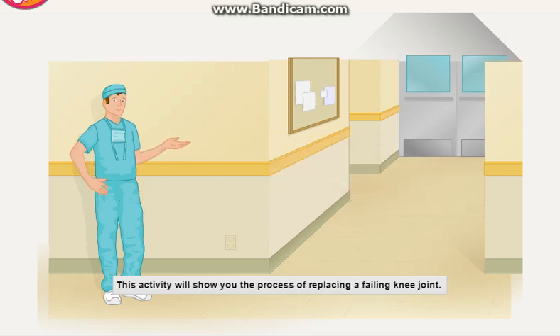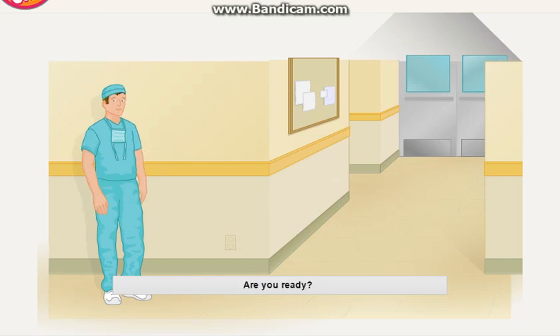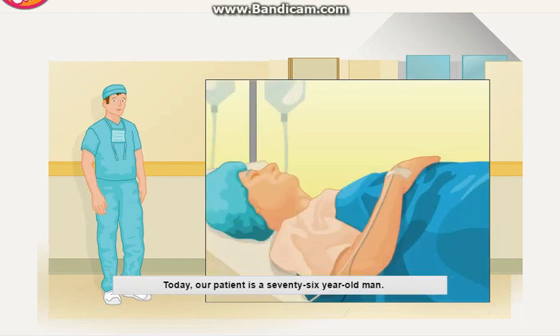Virtual knee surgery. This activity will show you the process of replacing a failing knee joint. Are you ready? Today, our patient is a 76-year-old man.